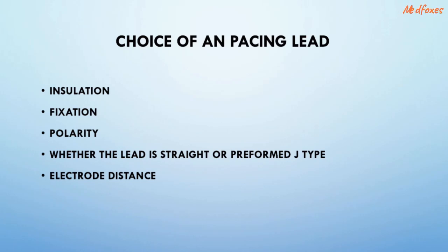This distance may not only affect the duration of intracardiac EGM signals, but also usually has an effect on the amplitude and slew rate of electrogram signals, depending on the low and high frequency bandpass filter in the input amplifier of the device. A lead with greater distance between electrodes will generally have a larger amplitude far field signal, that is, the R wave may be sensed on the atrial lead. These characteristics may affect the reliability of mode switching.